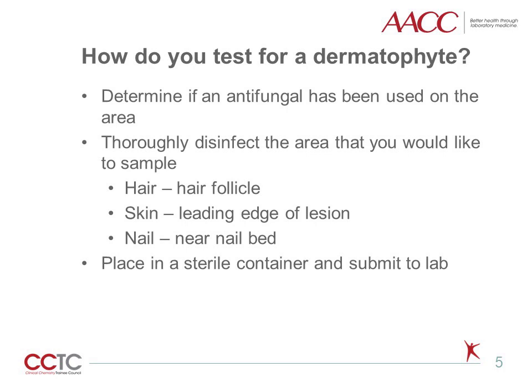The next step is to prepare the sampling area by disinfecting the region that you will be sampling with 70% ethanol. For hair samples, it is best to use sterile forceps to pull out 10 to 12 hairs near the root such that the follicle can be tested. Select hairs that appear damaged or utilize a Woods lamp to identify fluorescing hairs, as these can indicate infection.